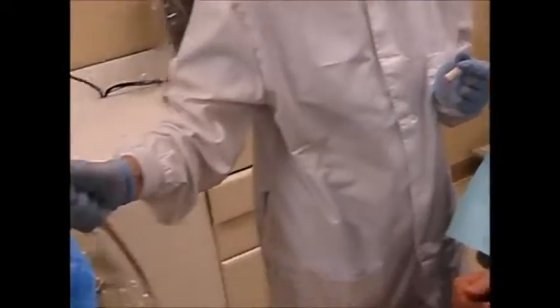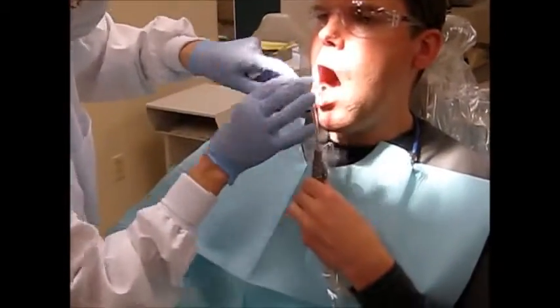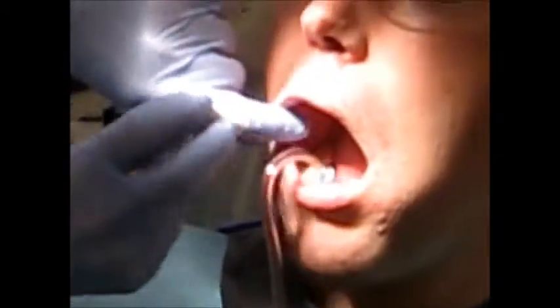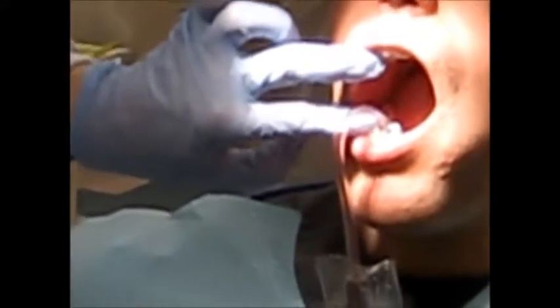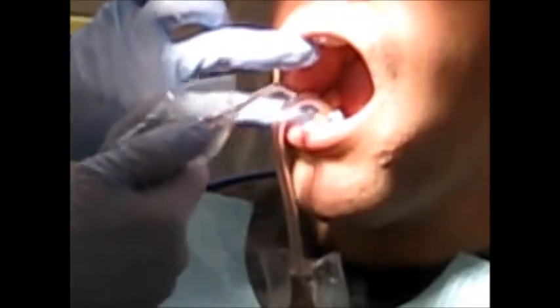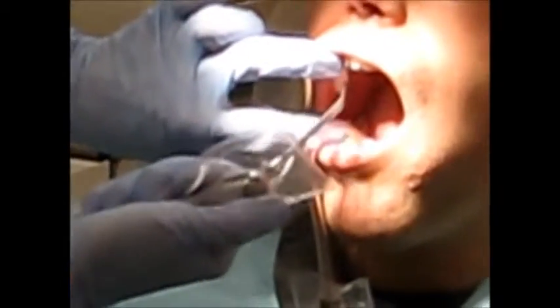I'm going to test my air syringe. I'll take the 4 cotton rolls all at once, and I will isolate each vestibule. Place the cotton rolls down into the vestibules because I want to dry the oral cavity and the teeth. The fluoride uptake is more efficient in a drier environment. Assess your air again and let the patient know you're going to dry the teeth with air. Again, fluoride uptake is more efficient in a dry environment.